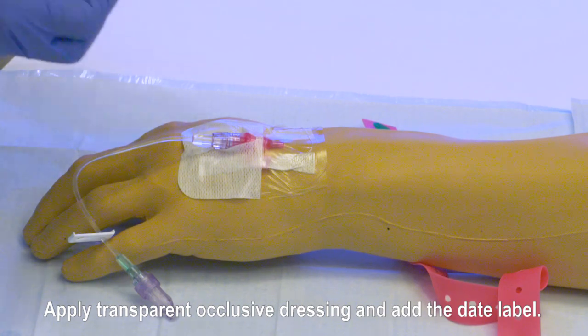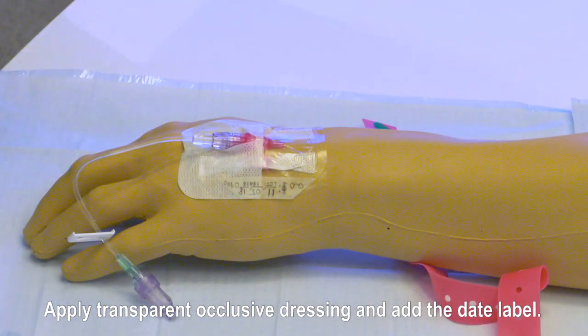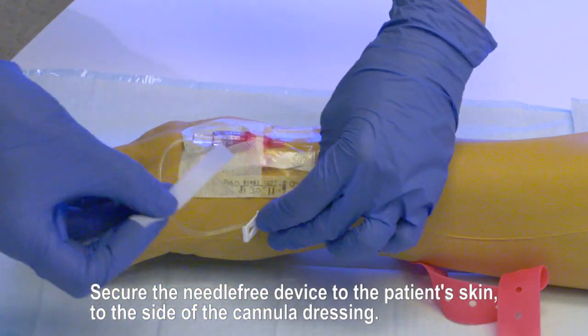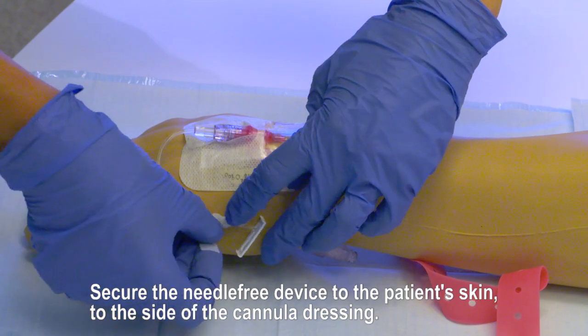Take care to secure the needle-free device to the patient's skin to the side of the cannula dressing.